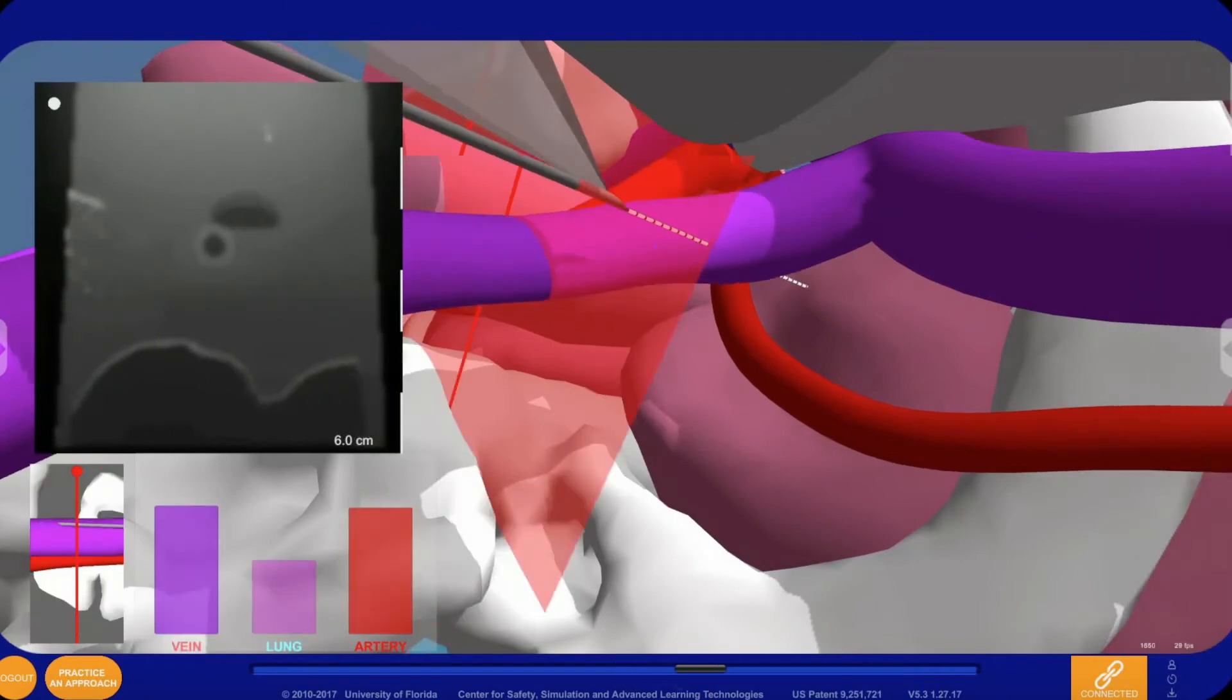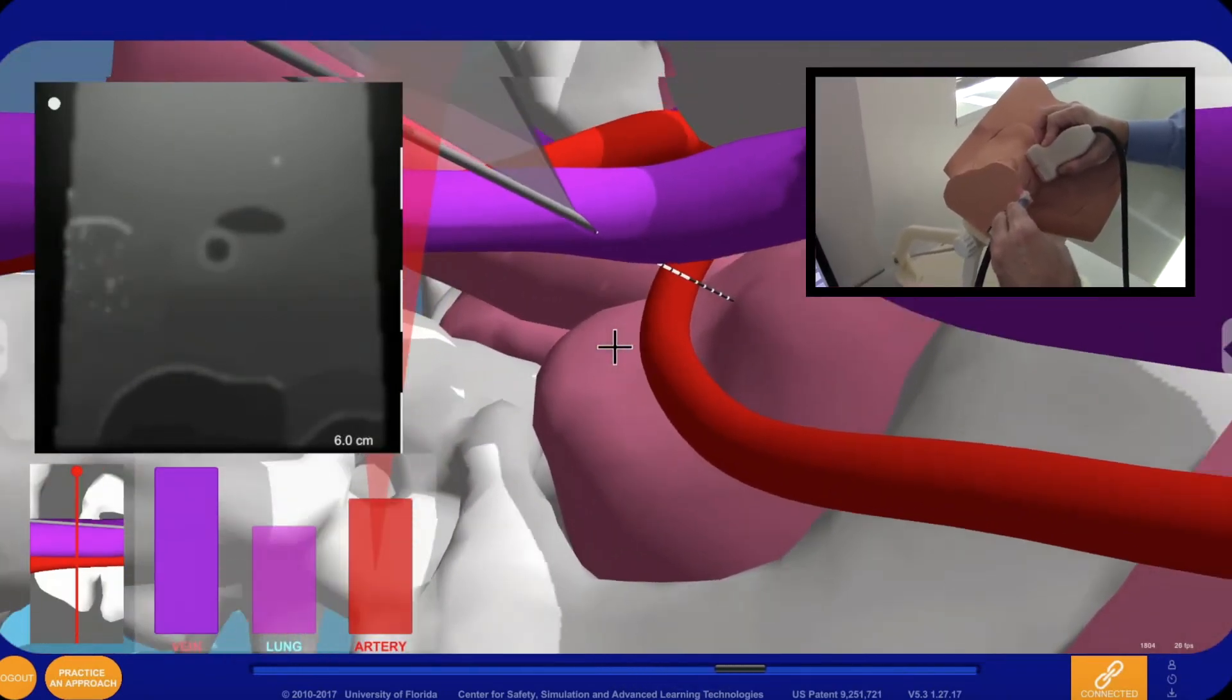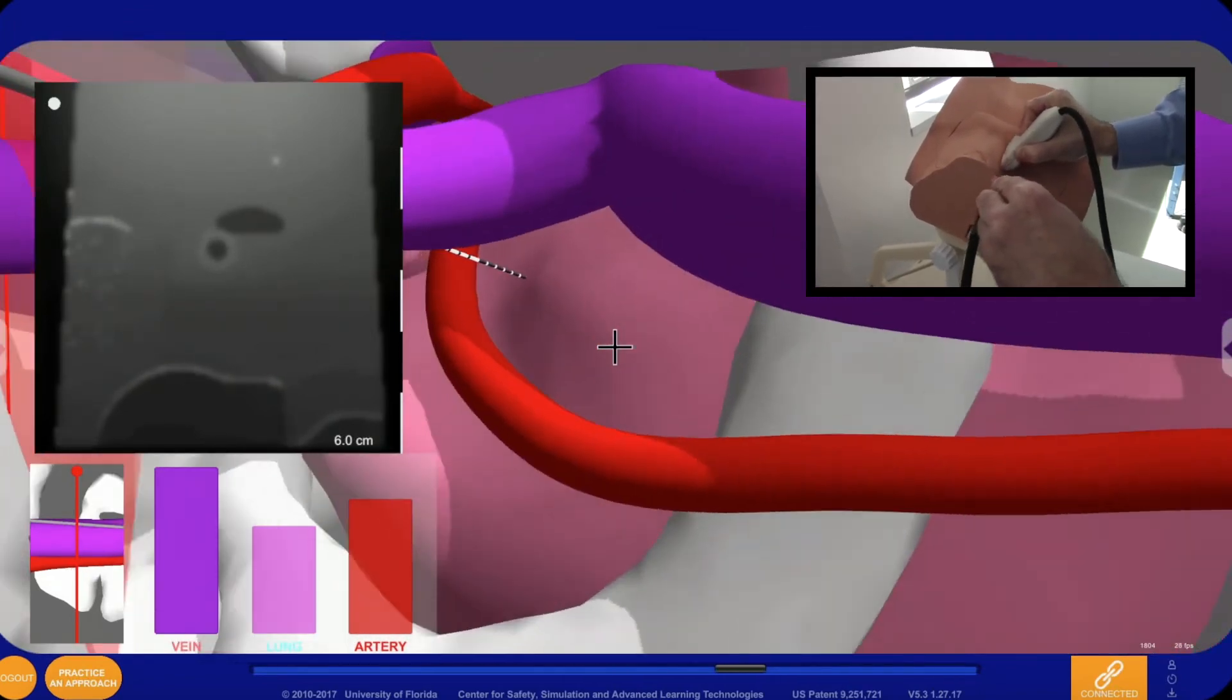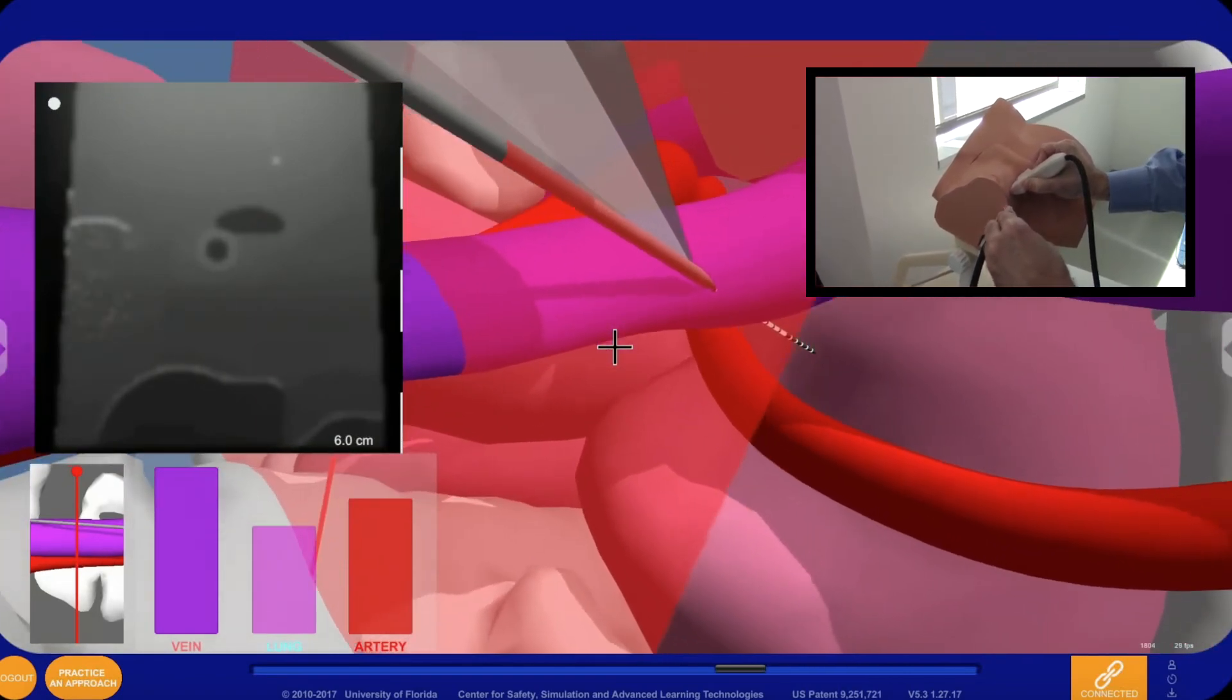The simulator includes custom cognitive aids that help instructors and learners use the simulator. One is a view of the needle and anatomy from the ultrasound probe's perspective. This view is aligned with the probe's axis and looks out along the insonating plane shown as a red line.